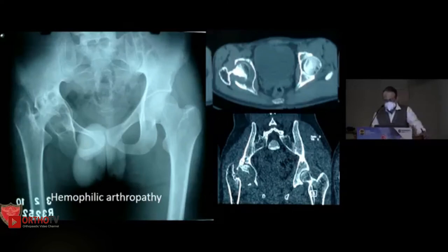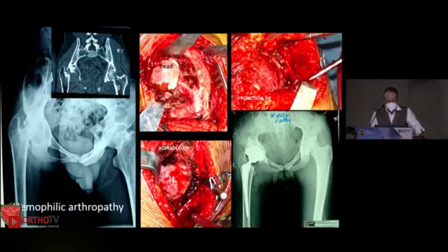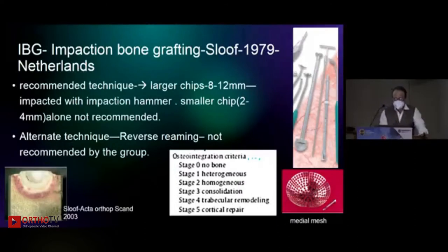Primary protrusio is not very common in our experience; secondary protrusio is very common — for example, hemophilic arthropathy. Again, this is a protrusio case. I will not go into superior and medial migration types — these are pure medial protrusio, and again you follow the same principle. If you see the post-op, the head is below the level of the trochanter, but that's what was possible.